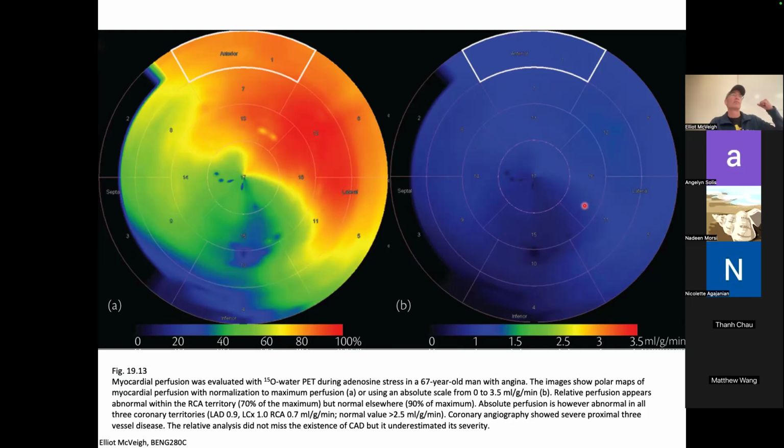That means they've got a big stenosis in their right coronary artery, probably a big stenosis in their LAD and in their circ. So when you do the angiogram and you look at this, you expect to see lesions everywhere, right? A lot of people in SPECT, sometimes it'll be 1 and there's no gradient, right? And so for the SPECT scan, it looks like there's no flow abnormality. In this case, at least you could see there was some kind of abnormality.